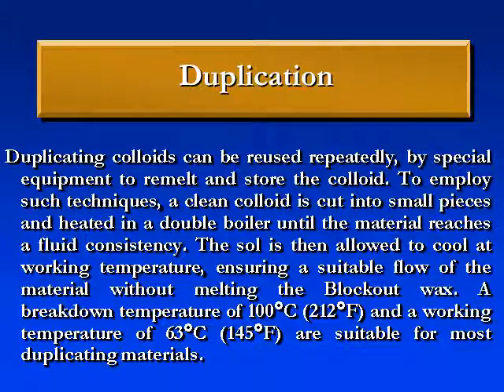So we have here important notes. The duplicating colloids or reversible hydrocolloid can be repeatedly reused. Why? Because it is reversible. So by special equipment we remelt and then store the colloid.